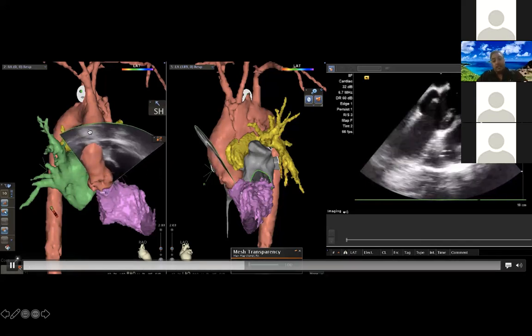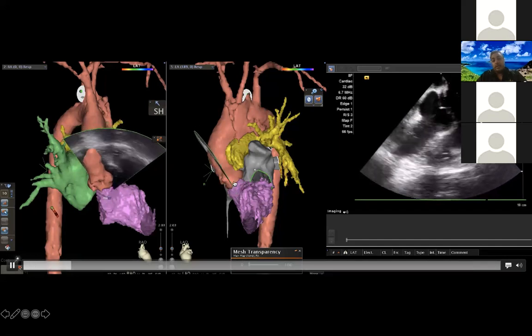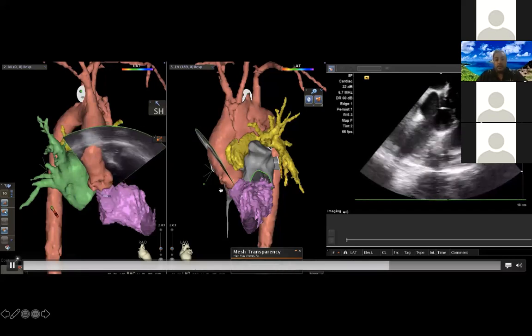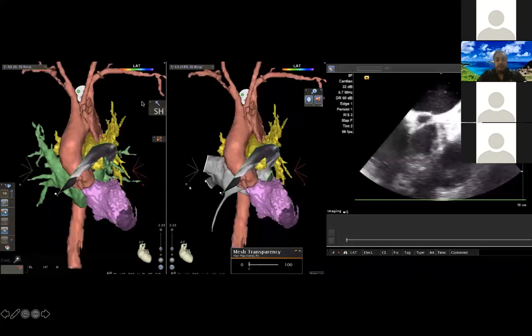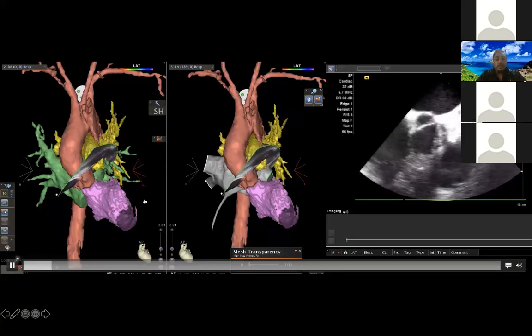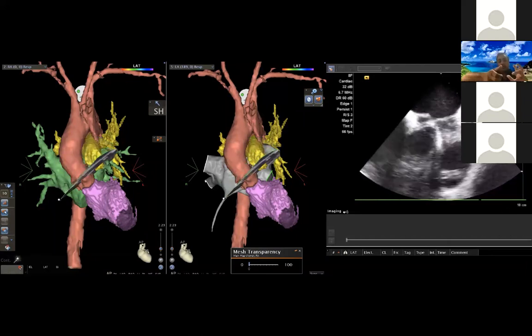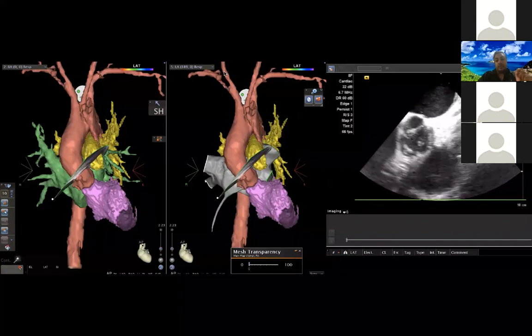And you can see here what I've done is I have the CT all lined up. So you can see exactly how the ICE catheter and the field of view is cutting through the aorta here. You can also get a very similar view of the aorta by staying in the right atrium and posterior tilt, right? So almost always, if you're in the mid-right atrium and you posterior steer your ICE catheter, oftentimes the aortic valve will come right into view.